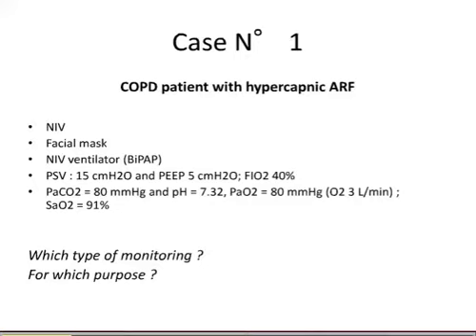The PCO2 is too high and the pH is quite normal. Well, it's not normal, but it's safe. Maybe we should discuss the specific monitoring of the ventilatory parameters for the respiratory status. What is the first goal of the monitoring as regards the efficiency of non-invasive ventilation? What do we have to look at?